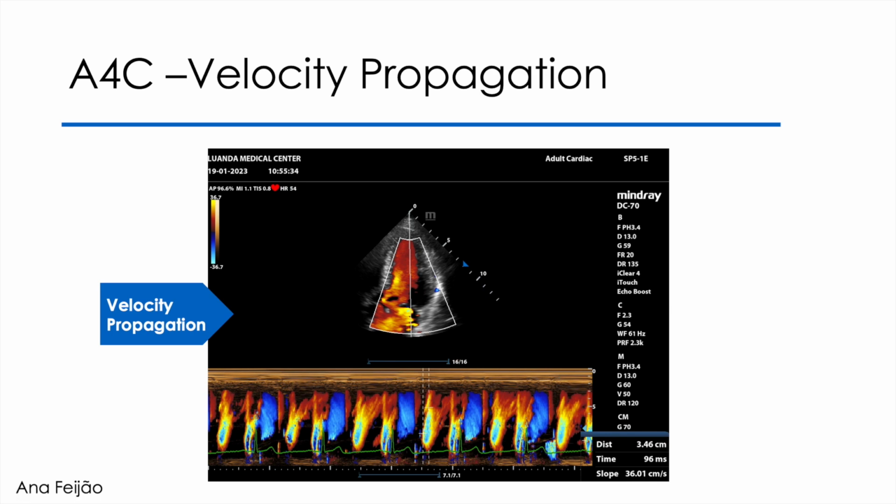To calculate the propagation velocity, we must place the color Doppler window over the mitral valve. I call the color Doppler window, lower the general bidimensional gains, and orient the sector size so that the left ventricle inflow track is in the middle, and be able to perceive the dynamics of the diastolic flow right at the entrance of the left ventricle.